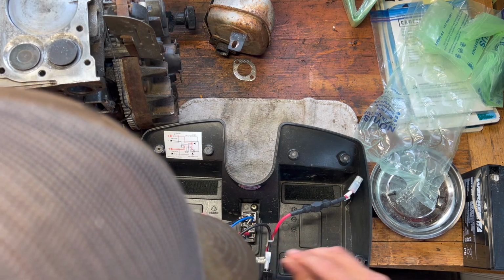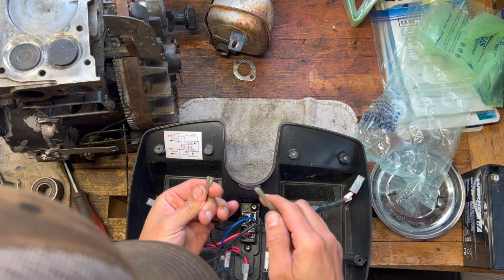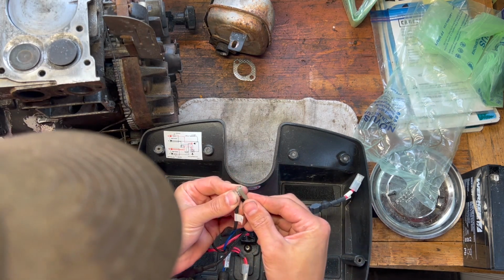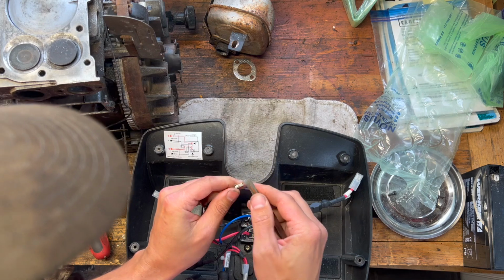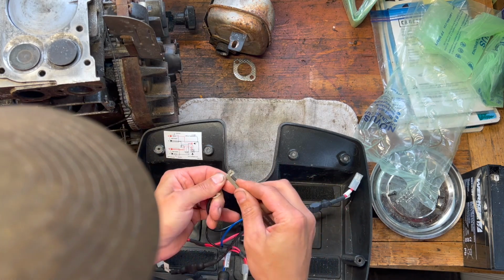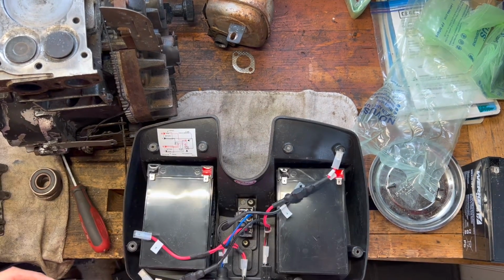These ones look pretty good. This one's the cruddiest one. These two, but really just this one. So I'm going to work on this for a little while, try to clean this up as best I can. And then we should be able just to throw the batteries in and give it a test. So I'll bring you guys back in a minute after I get this cleaned up.